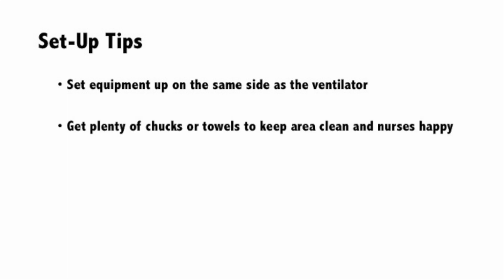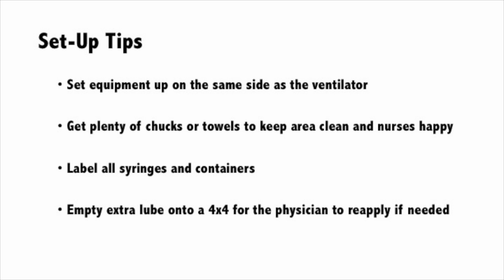Next, you want to get plenty of chucks and towels to keep the area clean, and this will keep your nurses happy. If you are using any syringes or preparing containers for mucus samples or cell washings, you want to make sure all of those are properly labeled so that you know which each one is. And then throughout the procedure, it is helpful to keep extra lube emptied out onto a 4x4 so that whoever's performing the bronchoscopy can easily apply this to the bronch if necessary.